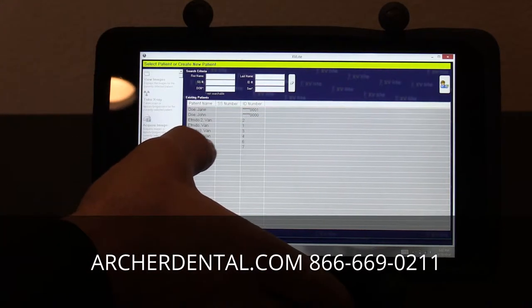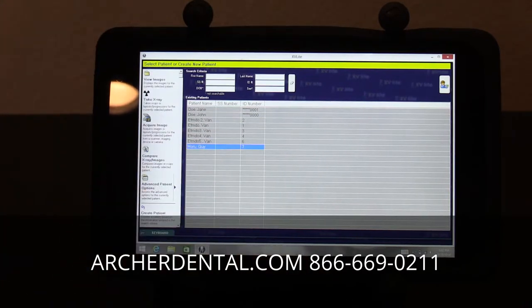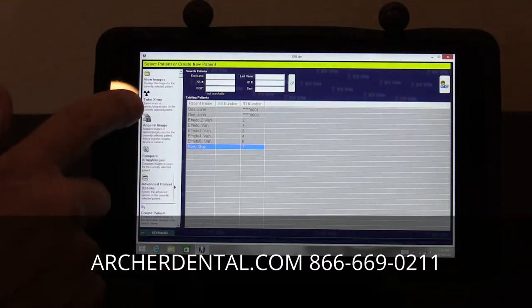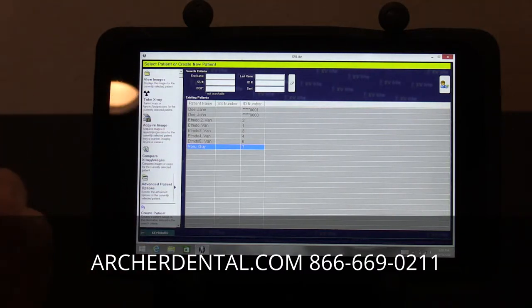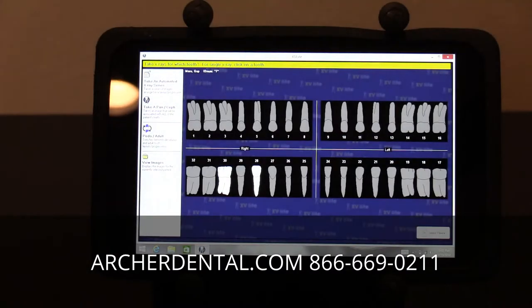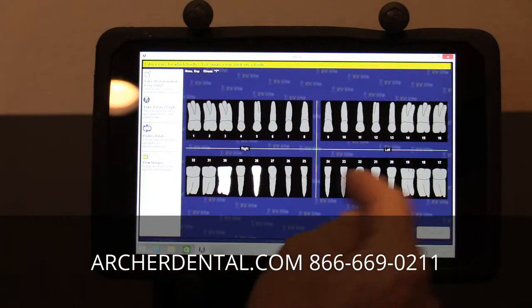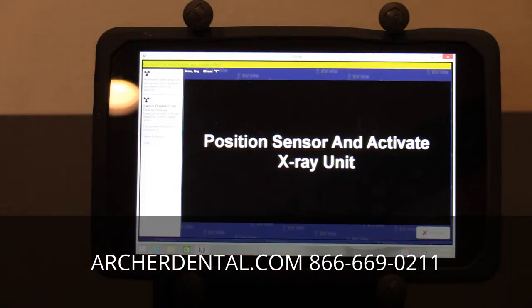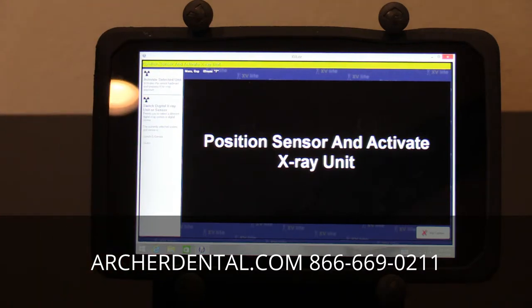Very simply, we're going to tap on the patient's name. We're going to either view existing images we've already taken or take a new X-ray. So today we'll pretend we're going to take a new X-ray. We select from the tooth chart where we're going to take it. If we had a sensor plugged in, we would then hit 'Activate Selected Unit.'